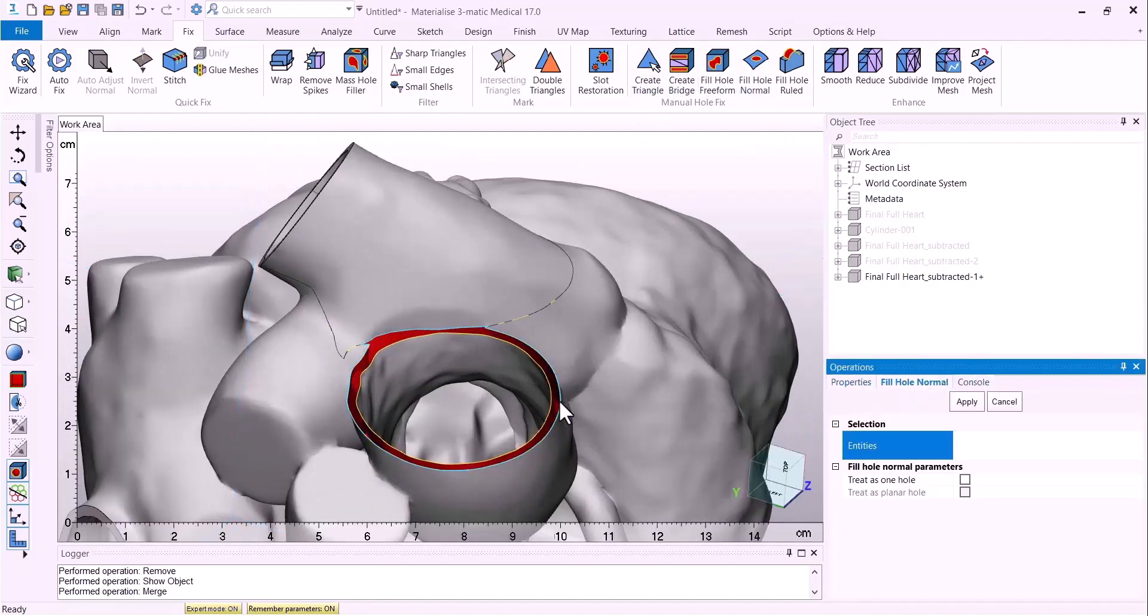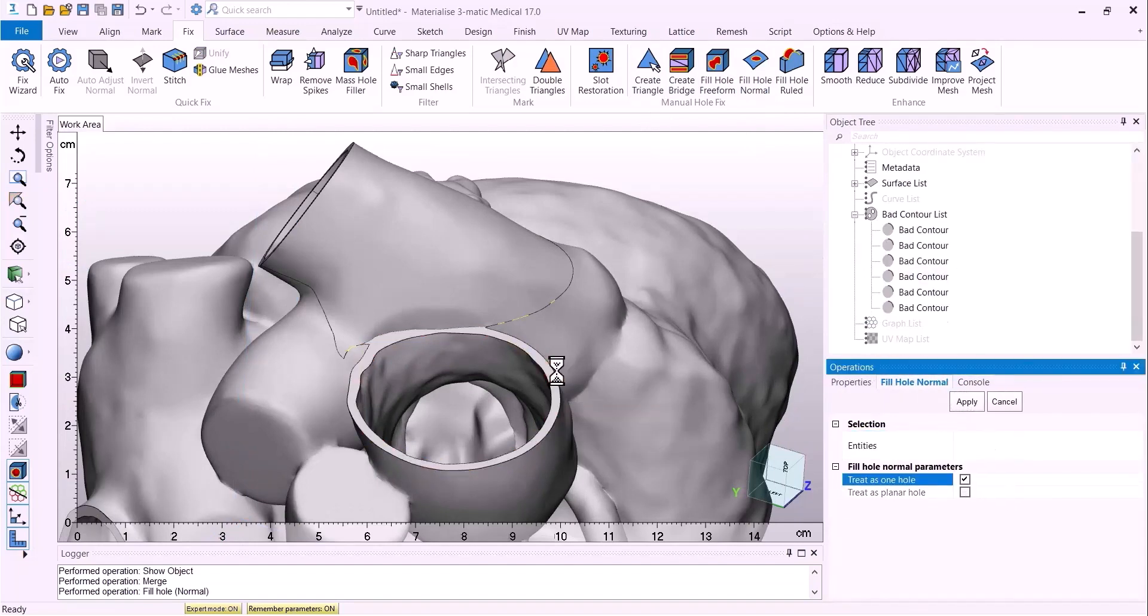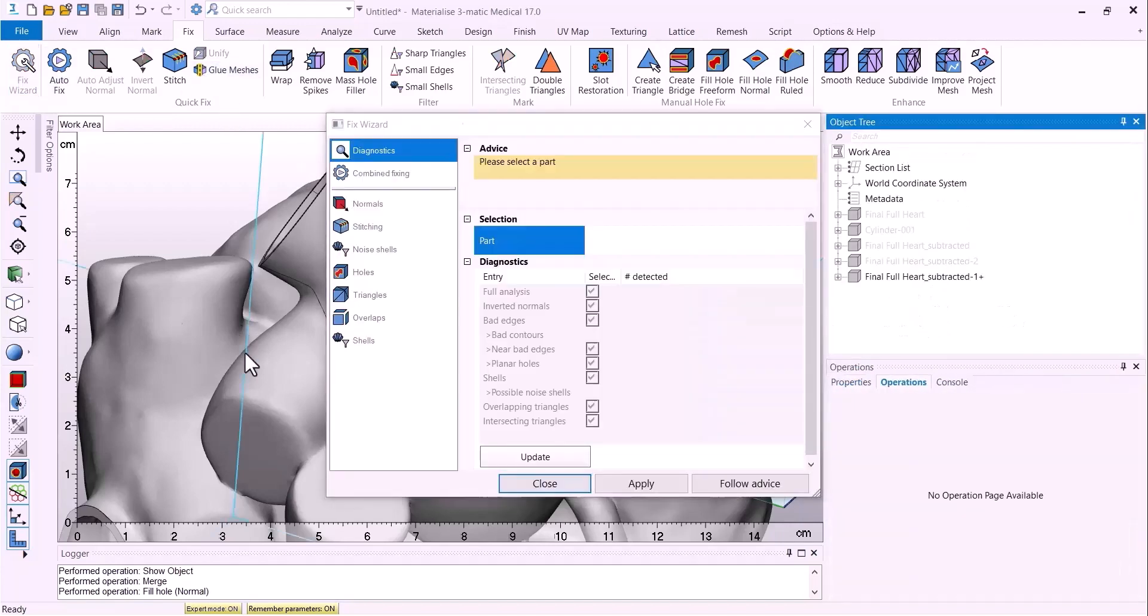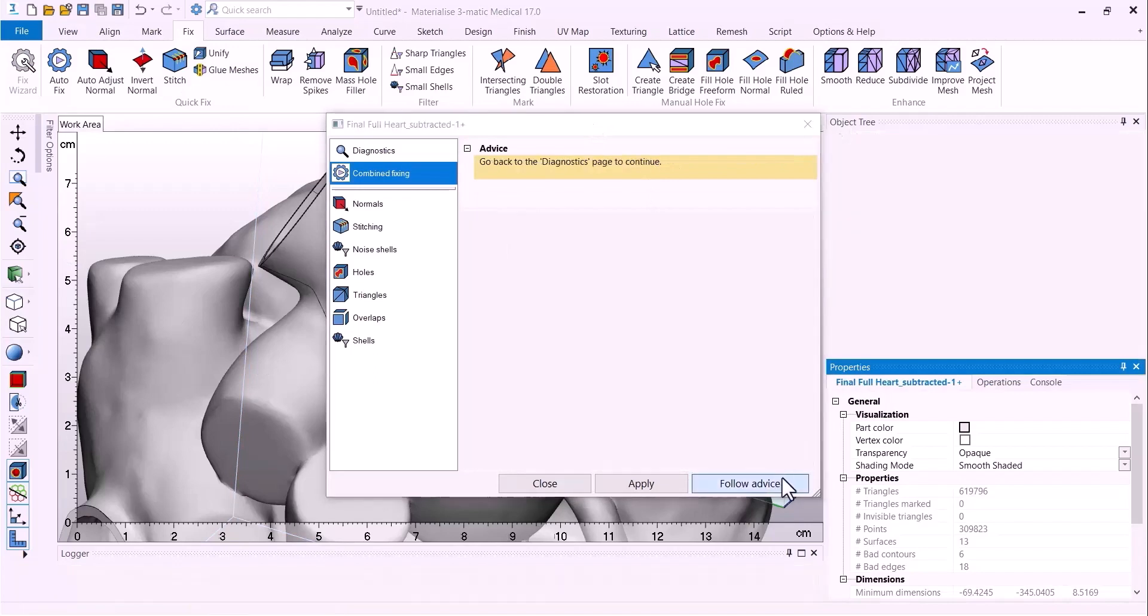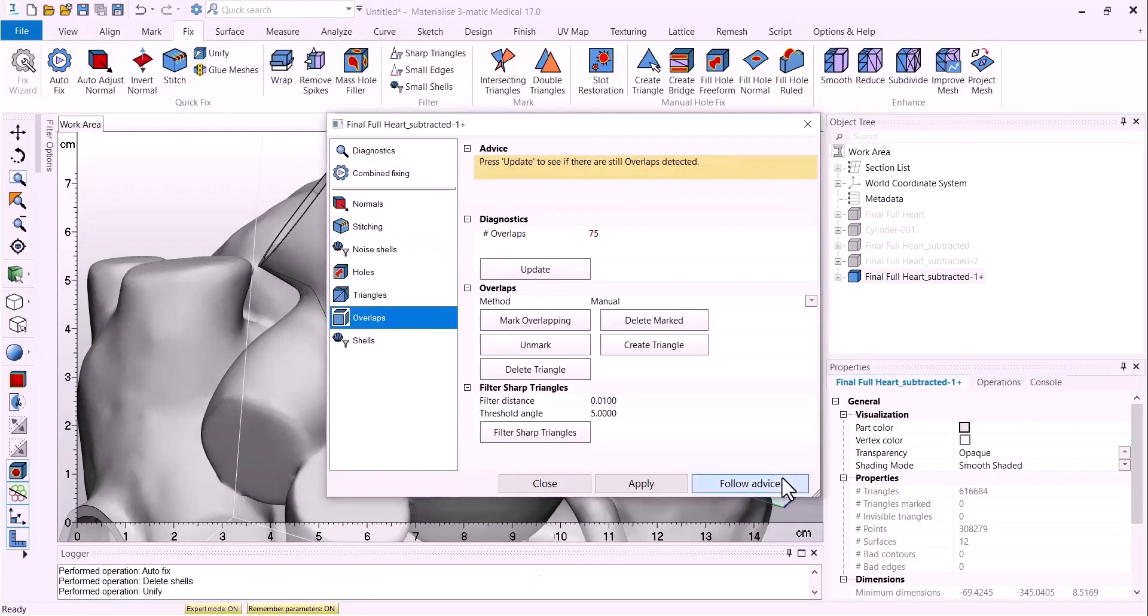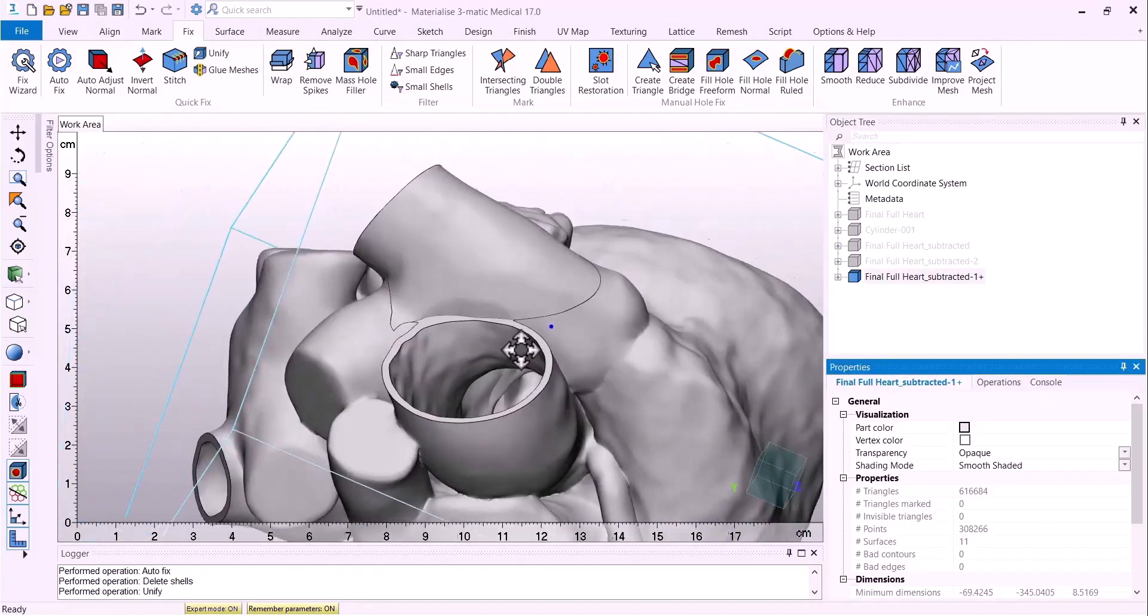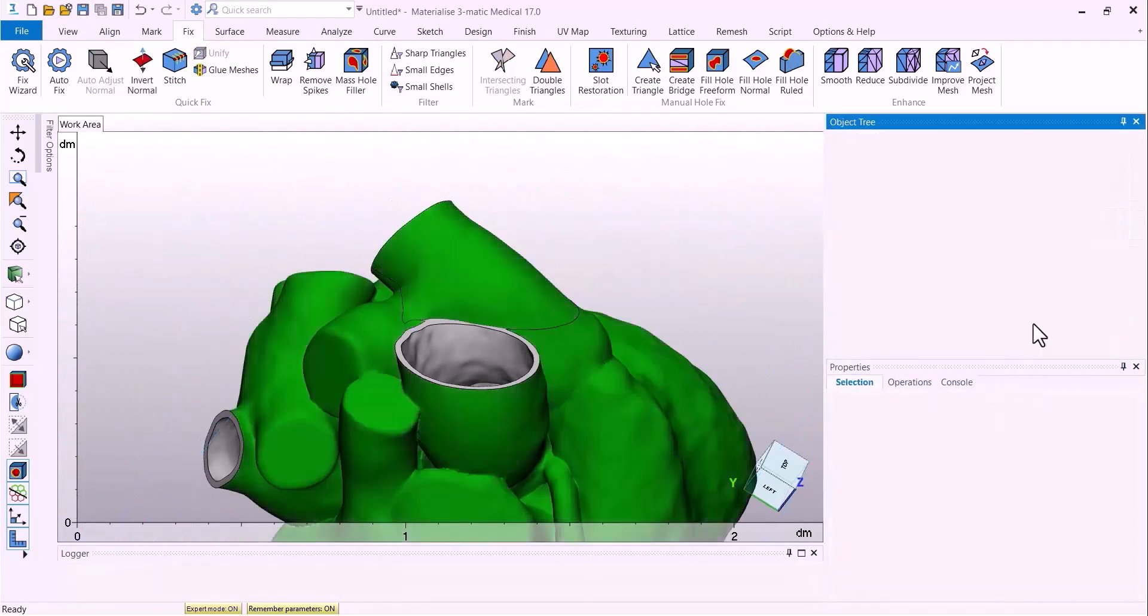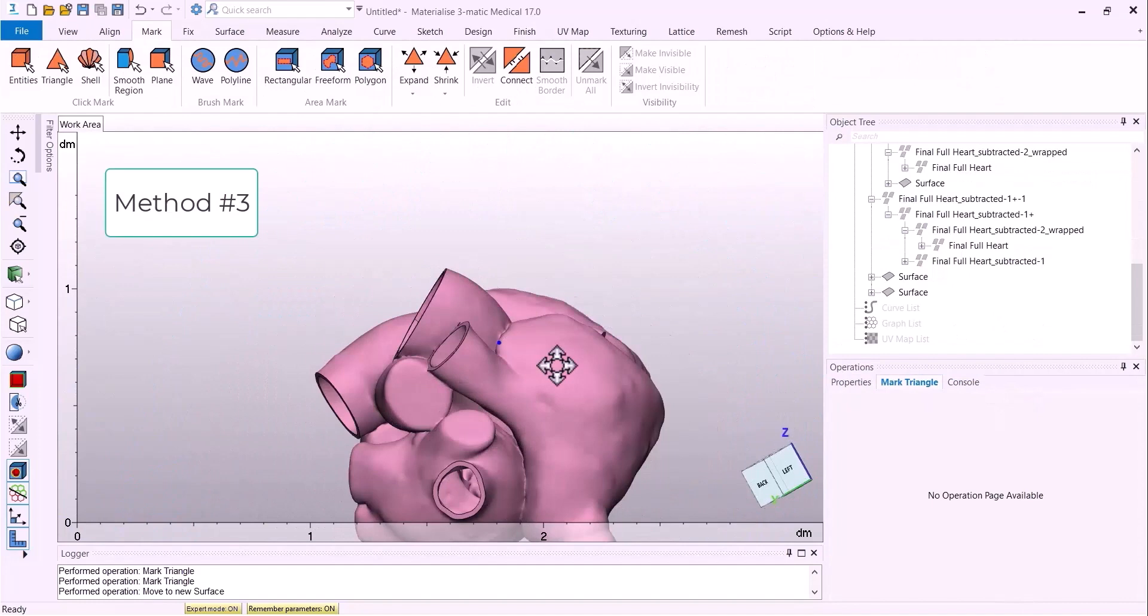Now to fill in that remaining open bad contour, we'll just use the fill hole normal tool. And then the fix wizard just to fix up any remaining issues we may have with this process. Feel free to merge the surfaces together if it looks cleaner that way for you.